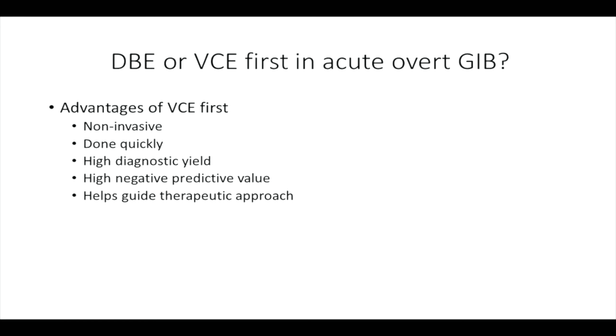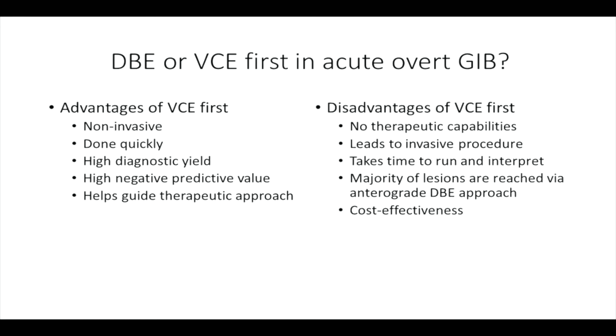Advantages of doing capsule first, of course, is that it's non-invasive. It can be done relatively quickly. It has a high diagnostic yield, especially in the acute setting, as we've shown. It has a high negative predictive value, and it helps guide the therapeutic approach. But there are disadvantages, of course.